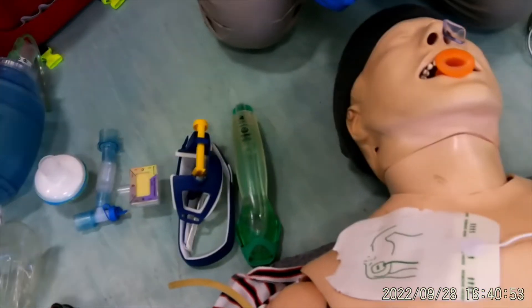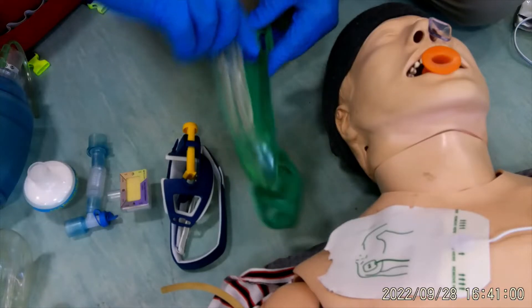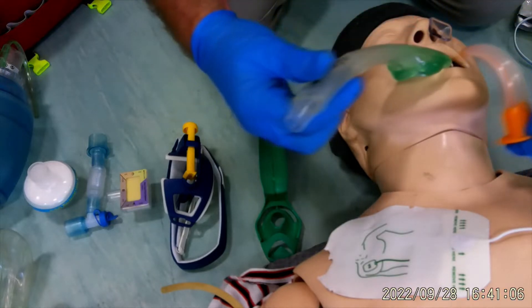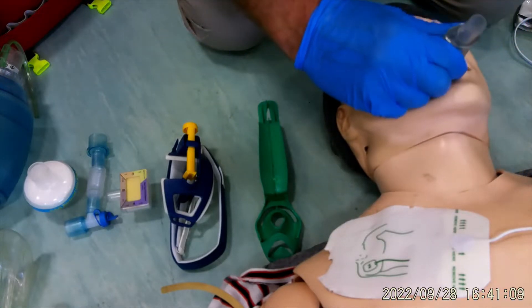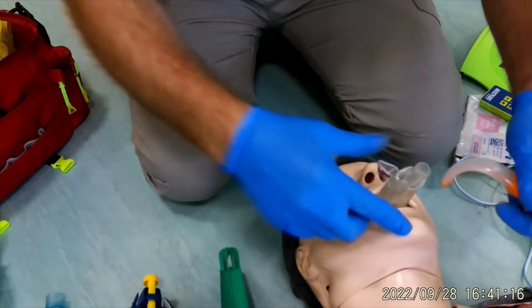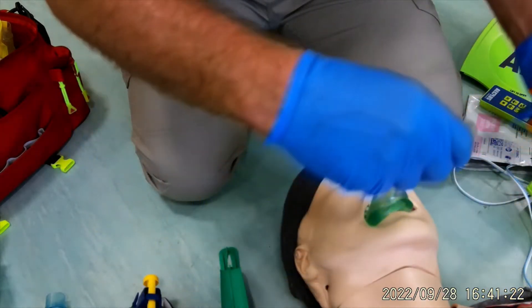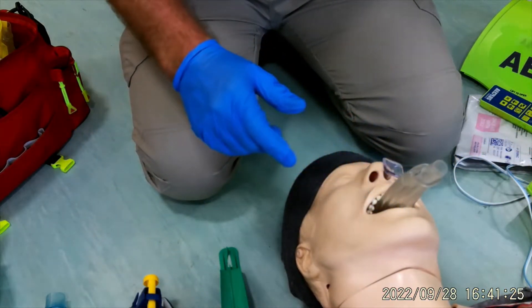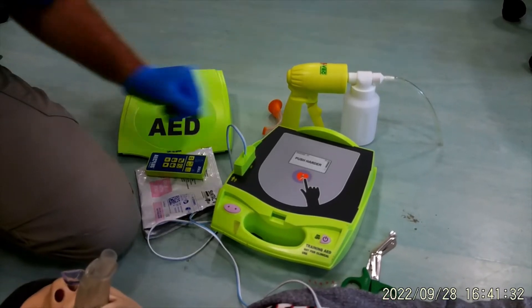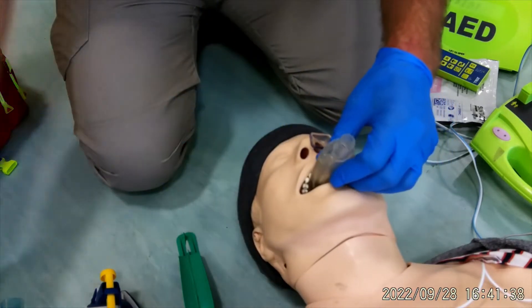When we're ready to change over, I ask my colleague to do continuous chest compressions. I take the i-gel out, lubricate it if required, and as the OPA comes out — remember that goes to the toes — the i-gel comes in and slides down into position. I place all clinical waste to one side, and now the i-gel is in the right position.